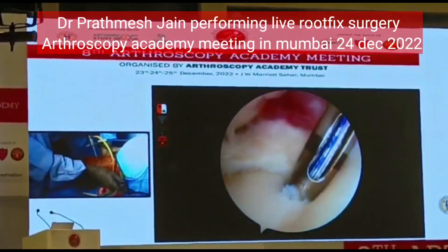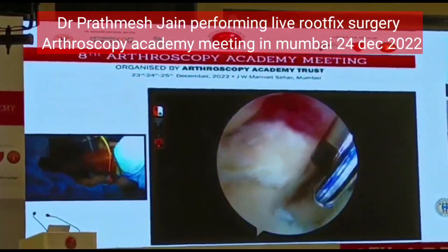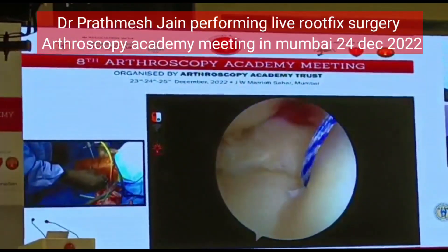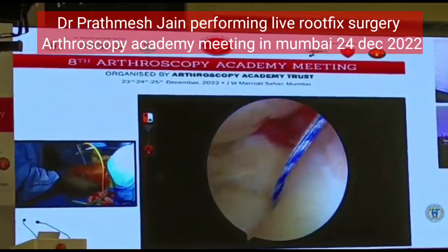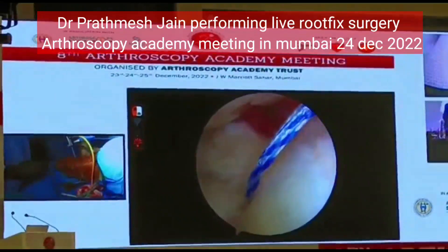No, we will do all the intra-articular work first and after that we will just do the osteotomy. Any specific reason why you finish the intra-articular work first? Because we want to correct all the intra-articular deformities first. And in this particular case the osteotomy is to protect our repair and to correct the alignment.